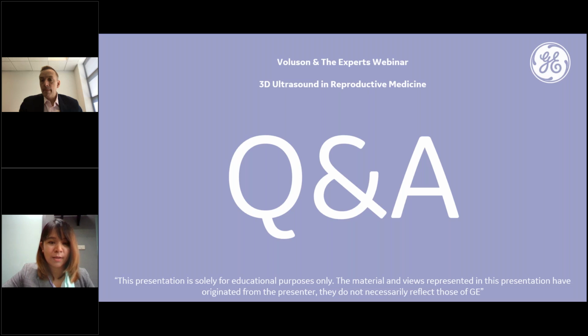Thank you for the question. And another question is, any tips for differentiation of subserous versus intramural fibroids? Yeah, that's another good question. I think, again, for me, when I'm trying to differentiate anatomical position, which, your question's a good one, but it could apply to many different things, couldn't it?